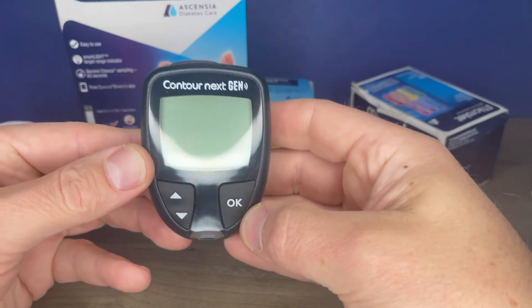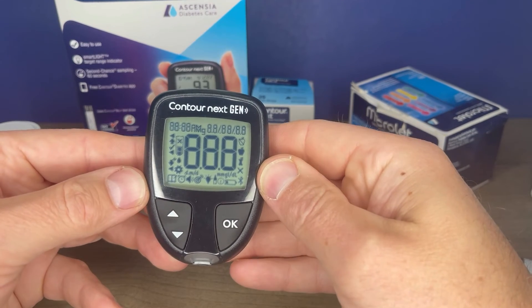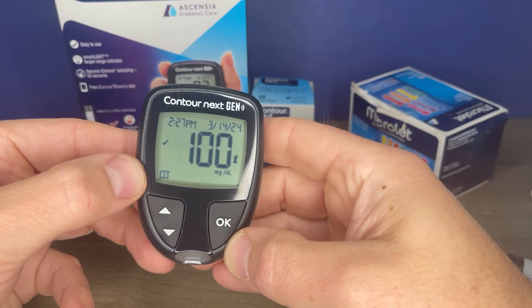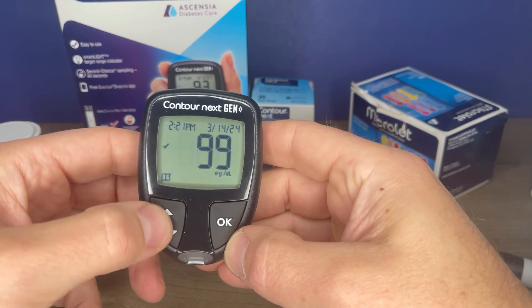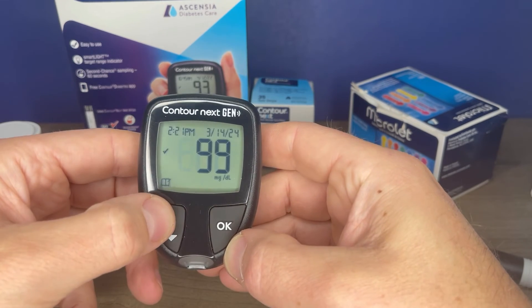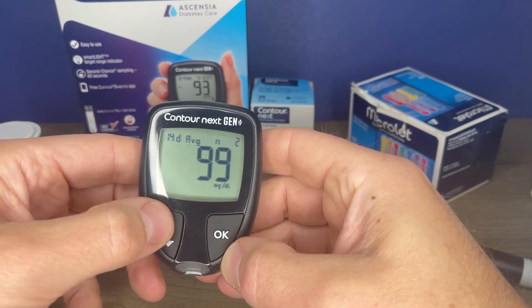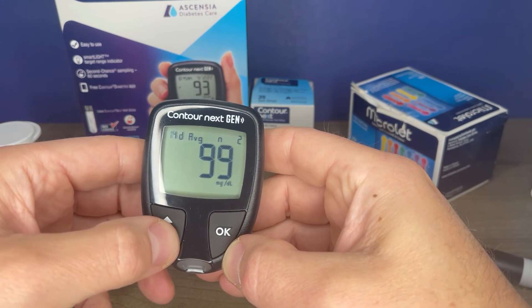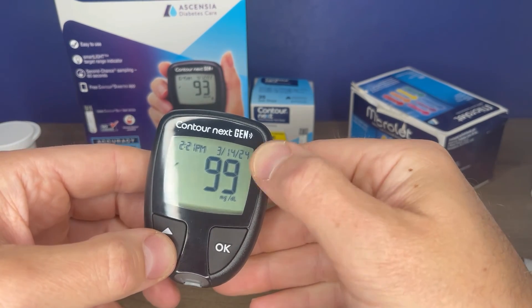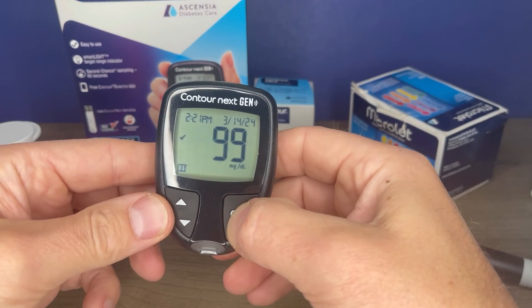If you wanted to look at your readings, hold the OK button to get to the main screen — the logbook will be flashing, so press OK, and use the up and down arrows to review your previous readings. It will calculate your averages, and you can look at the individual readings. If you used the meal marker, that will be indicated. If you didn't use the meal marker, there's no indication. Press and hold OK to power off.